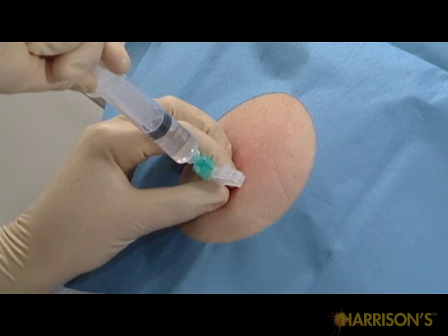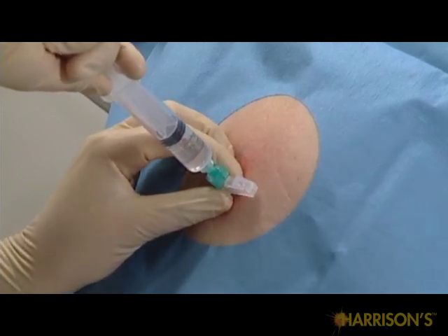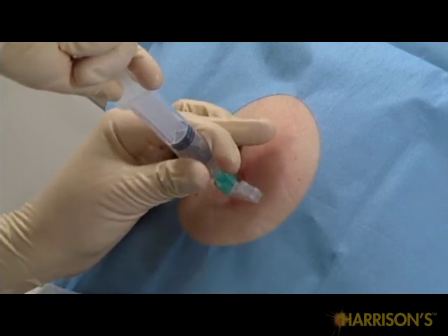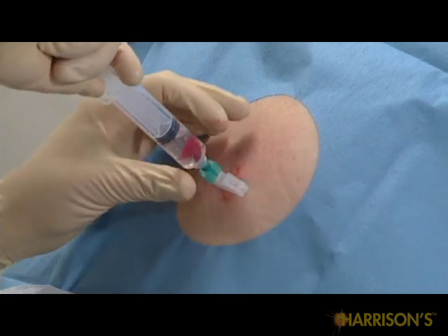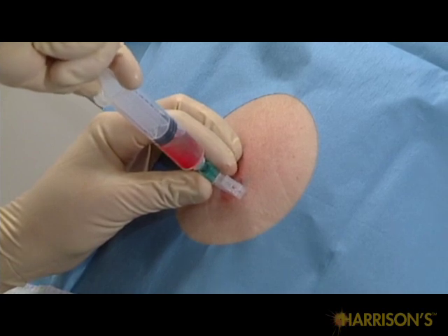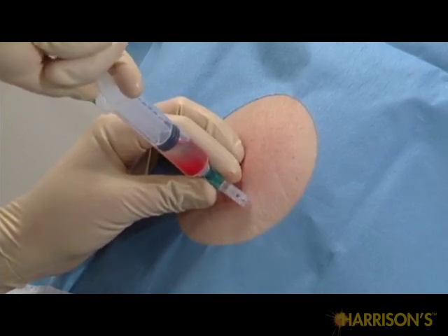While slowly drawing back with gentle pressure, enter your skin incision site, aiming immediately above a rib. Continue to draw back as you advance. As soon as fluid freely flows into your catheter, you have entered the pleural space.